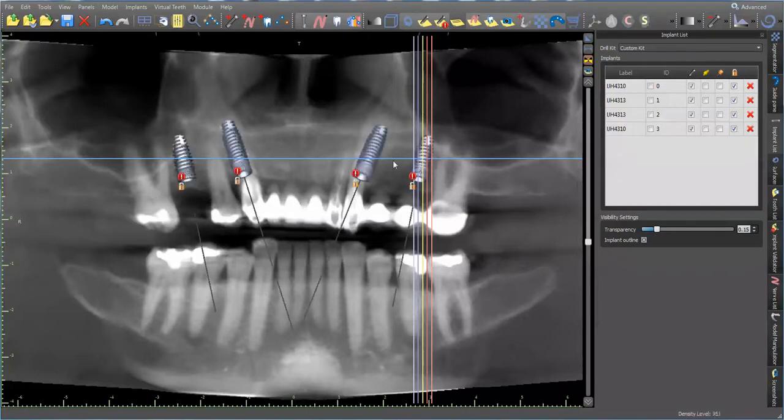We decided to place 4 implants, here, here, here, and here. And to save on money, we just elected to remove this tooth. It's kind of in the way, and all we had to do was a 4-unit full arch and keep her in first molar support. So I've already stitched this guy together. I've already placed the implants.